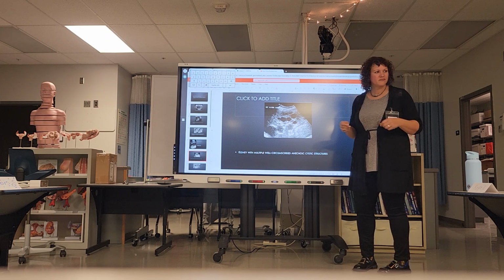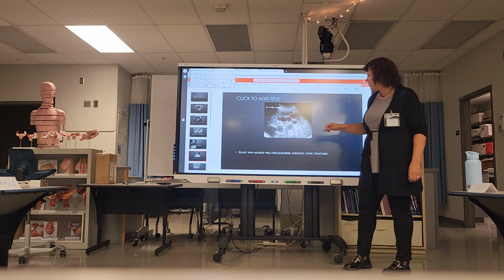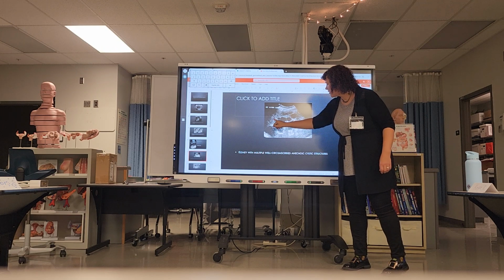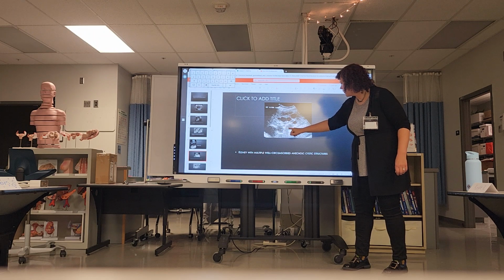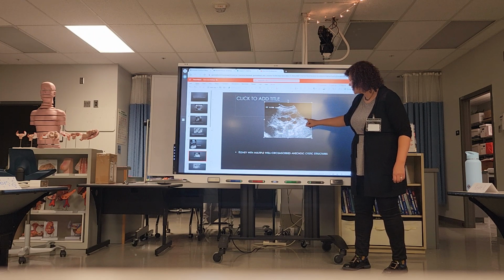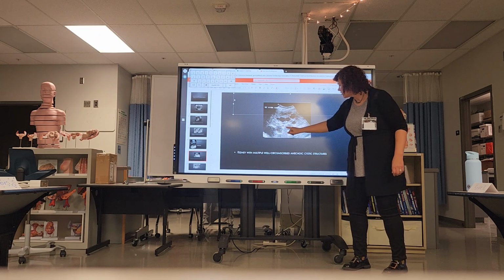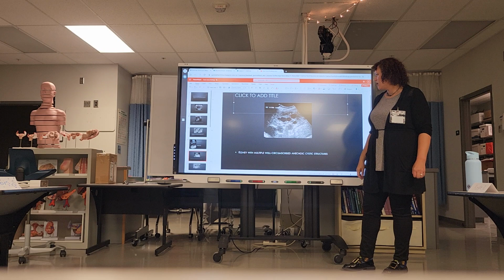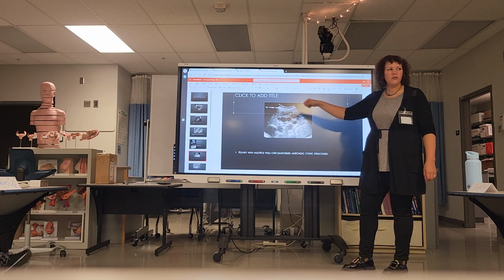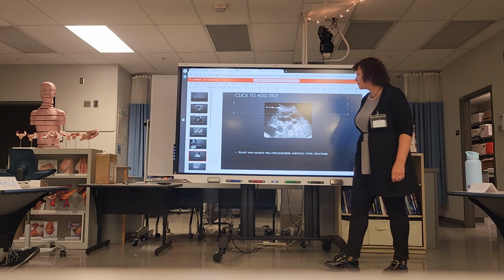Can you point out, draw out the edge of the kidney? Okay, yeah, so this is the superior pole around here. Okay, so midway, and then here's the inferior pole here. When you're scanning through, it would be easier to identify the tissue.